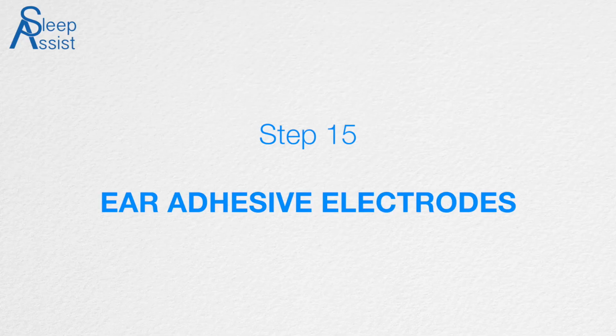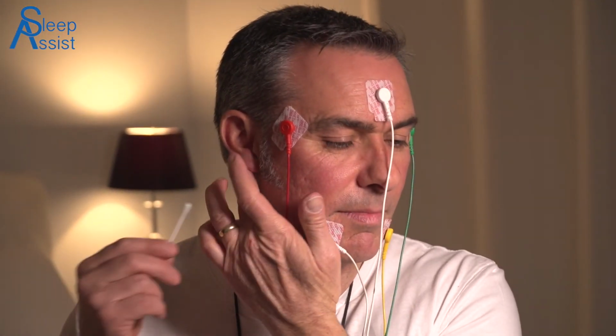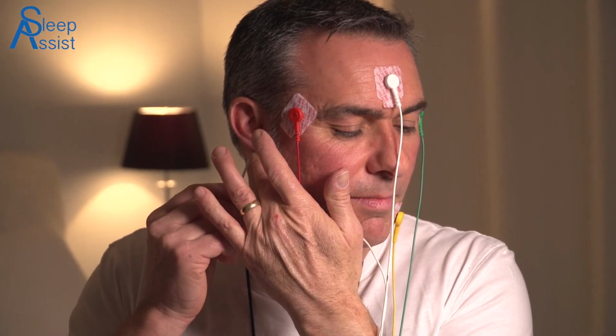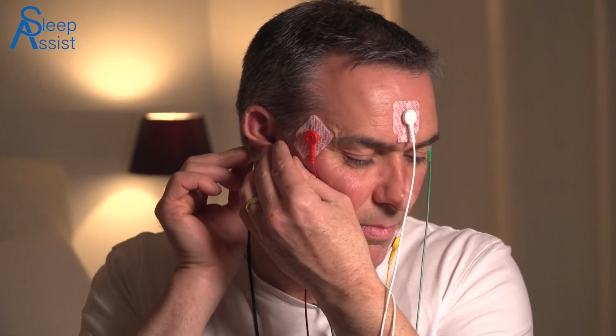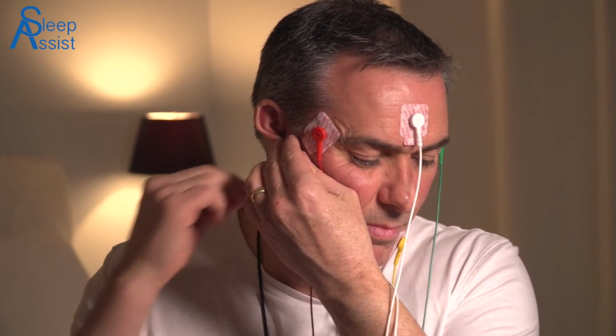Step 15. Ear adhesive electrodes. Identify the bone directly behind your right ear. This is important: the black dot of the electrodes must be placed on the bone and not the muscle tissue. Using a cotton bud dipped in Nuprep, clean a patch of skin behind your right ear, the size of a 50-cent piece, rubbing with the cotton bud for 20 seconds. With a fresh alcohol swab, wipe the area clean with one swipe only.